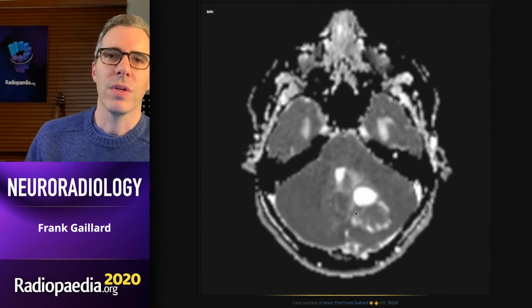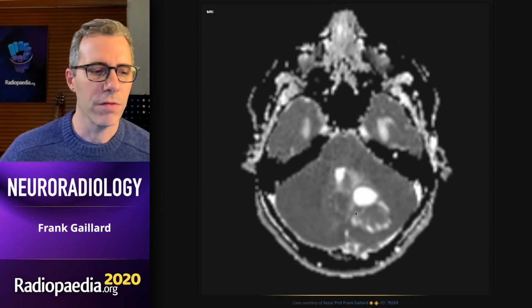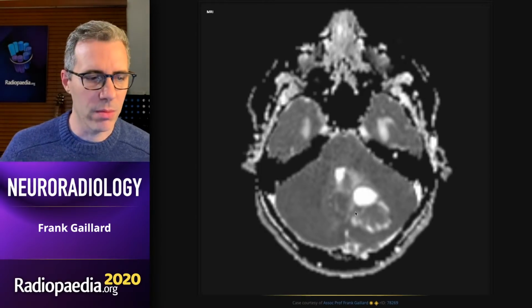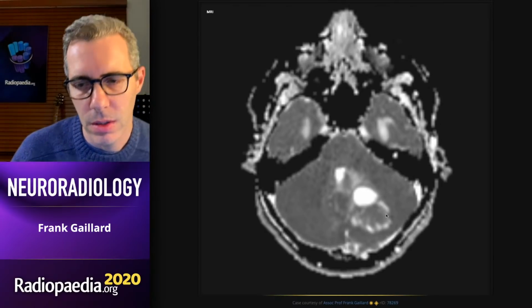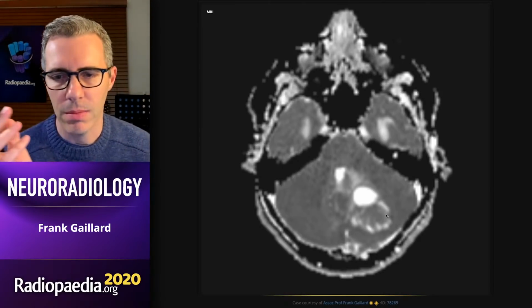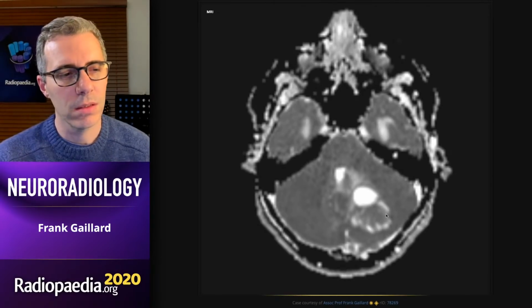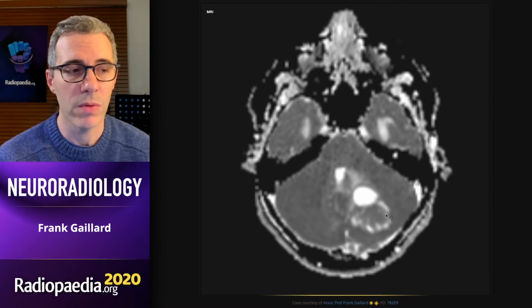So what's our differential here when we start to think about a youngish patient with a lateral and vermian cerebellar lesion? Well, the moment you say cyst with a mural nodule, you're going to be thinking of two lesions, and that is pilocytic astrocytoma that do occur in this age group. In this age group, they're more commonly supratentorial, but that's certainly a possibility. And hemangioblastoma, and they do occur in this age group. This would be more common in the setting of von Hippel-Lindau, where there could be multiple, so we do have multiple ones here.